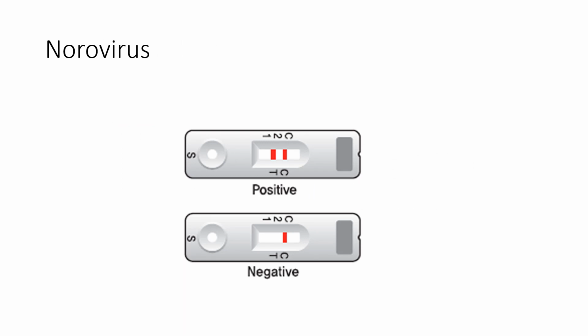You can test for norovirus in the exact same way, except that norovirus is a virus that is fecal oral, and so you're testing stool. So ELISAs are used all the time. They're super easy, and now that you are getting the idea behind an ELISA, maybe you're understanding the push currently to get an ELISA, an antibody test, for the SARS-CoV-2, because it's very easy to use.